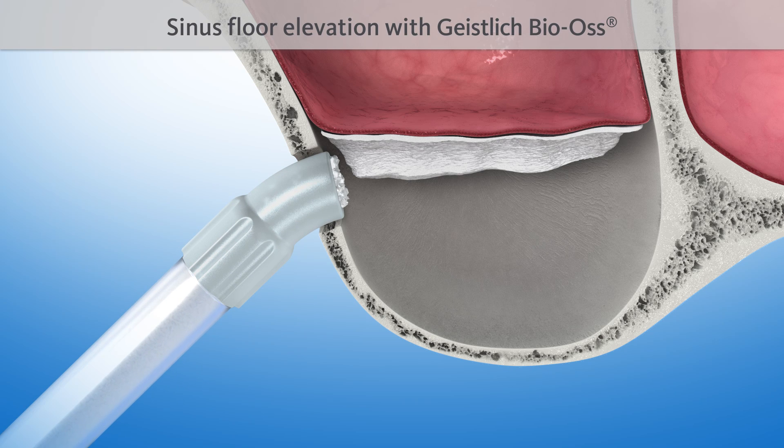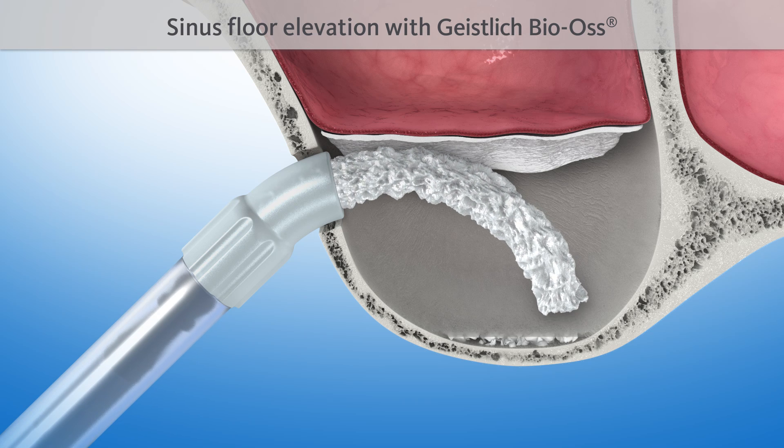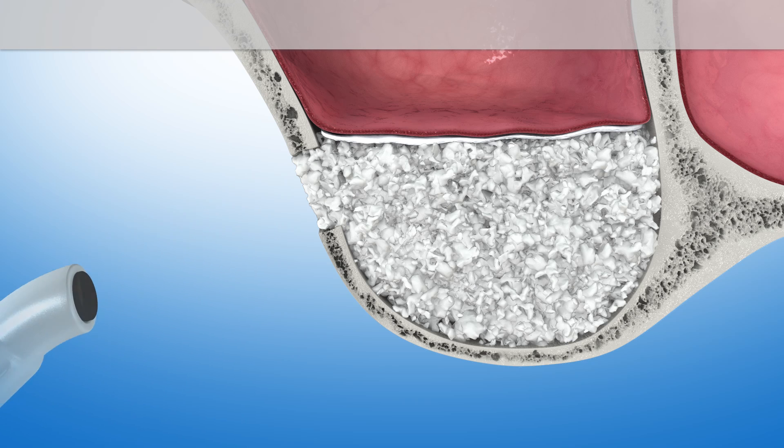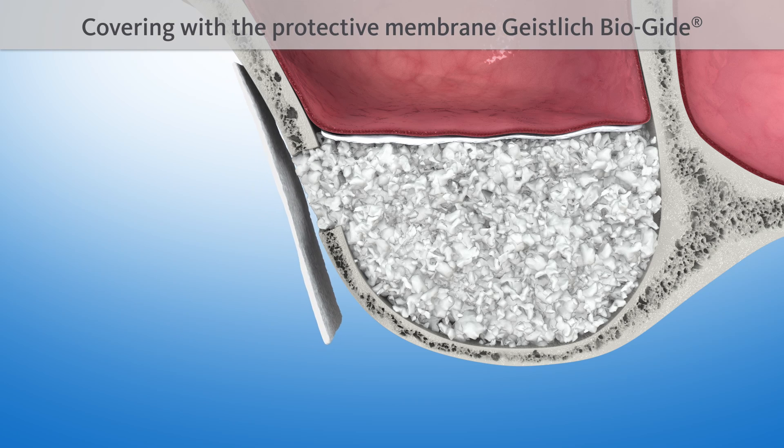The sinus floor is then elevated with a proven bone substitute material, such as Geistlich Bioss. The lateral opening is covered with another protective Geistlich Bioguide membrane.